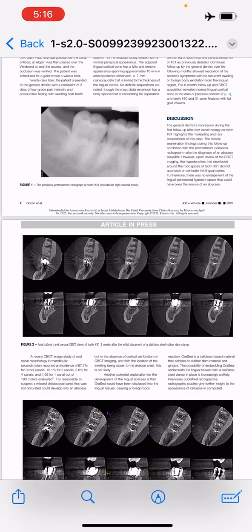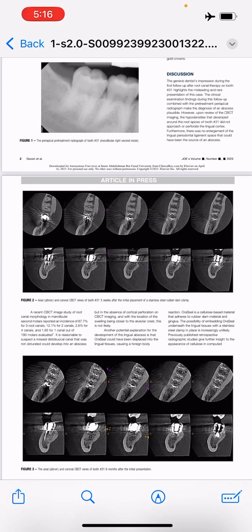Then the general dentist consulted an oral and maxillofacial surgeon and was advised to return to the treating dentist for CBCT review. 5 days later, the patient returned to the dentist complaining of sensitivity on biting and tenderness in the lower right jaw, and the clinical examination revealed that tooth number 30 was responsive but lingering to the cold test. The originally treating endodontist reviewed the CBCT imaging in addition to the radiologist's findings. They diagnosed tooth number 30 with symptomatic irreversible pulpitis.